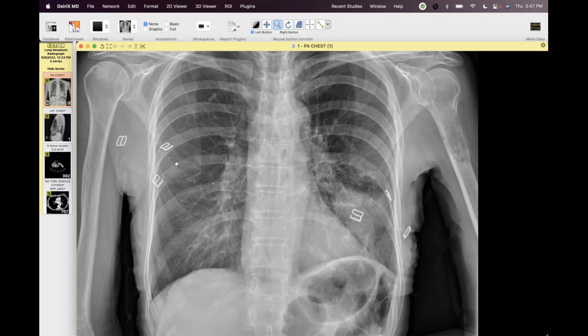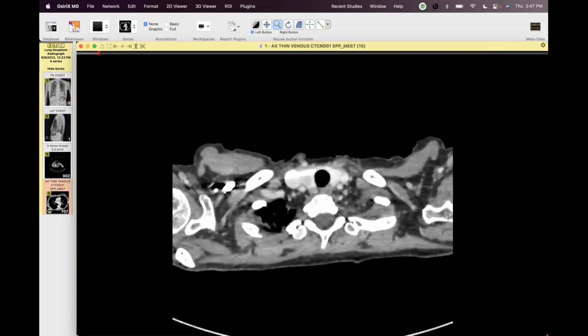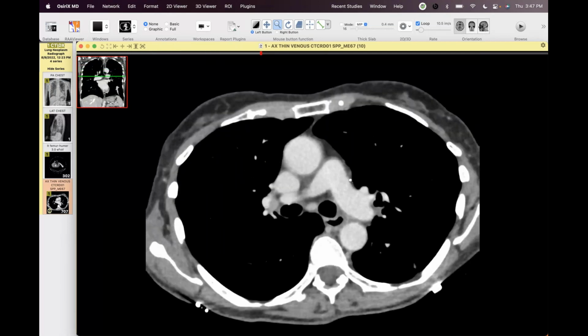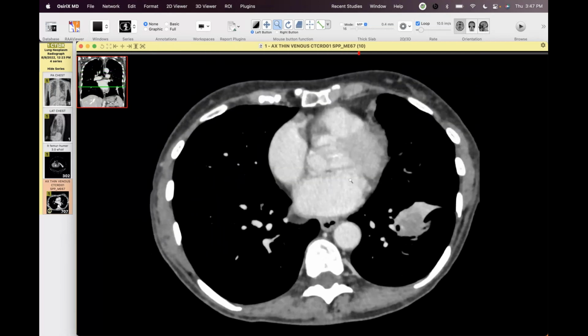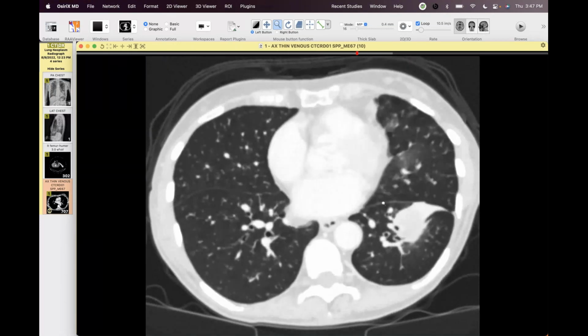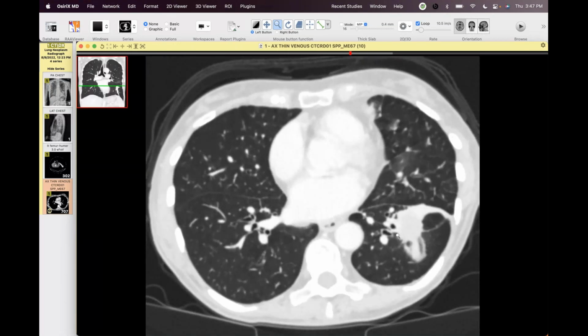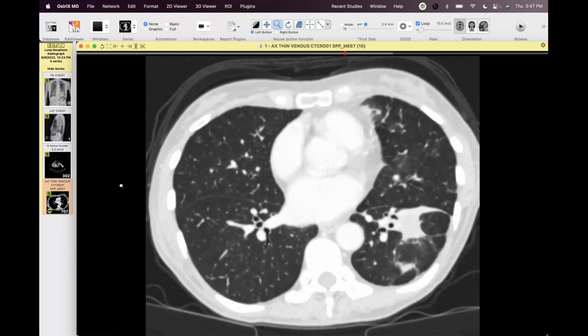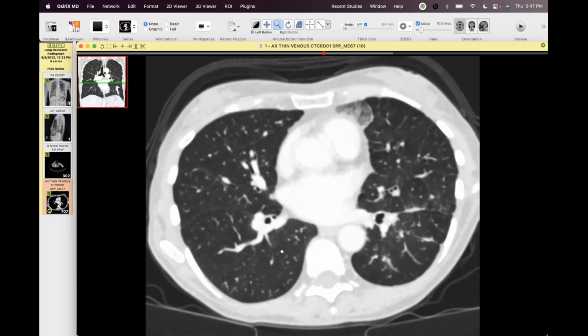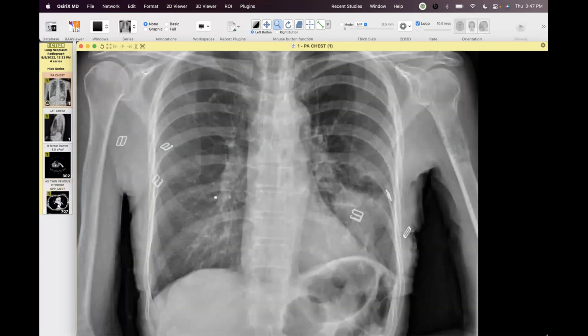And of course, this did turn out to be a primary lung cancer, and the CT just confirms that. Obviously stage 4 disease at the time of presentation with that humeral lesion. I don't even remember if they had additional foci of disease or not, but I just thought it was such an interesting radiograph. Yeah, very much so.